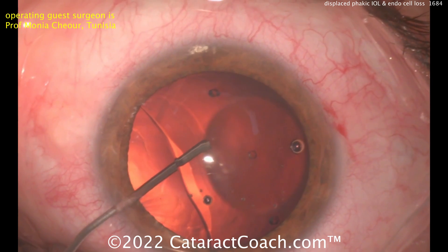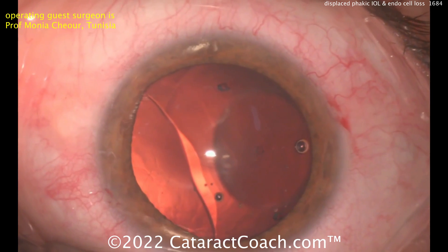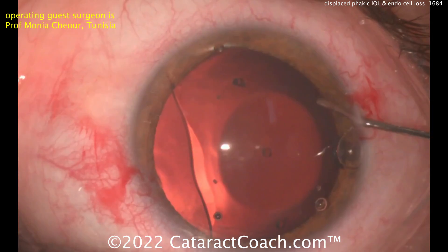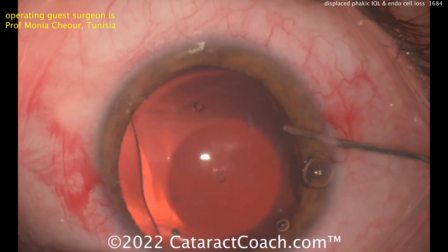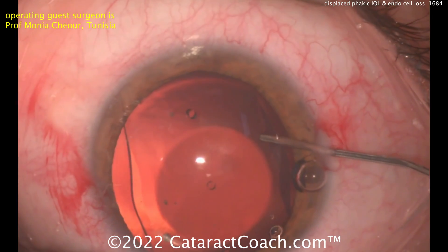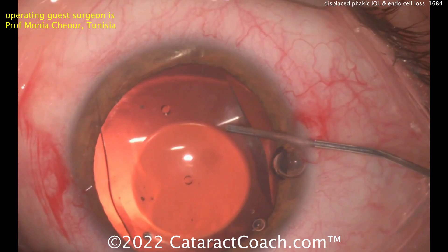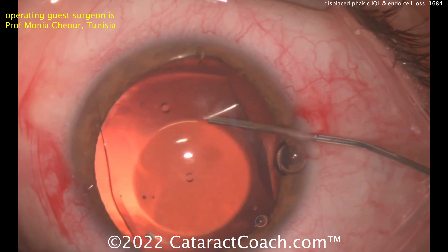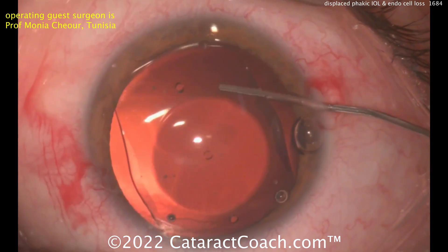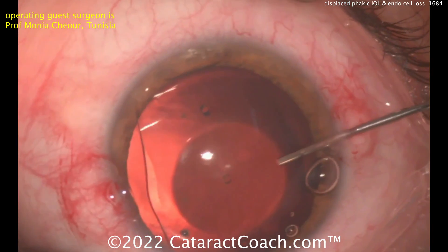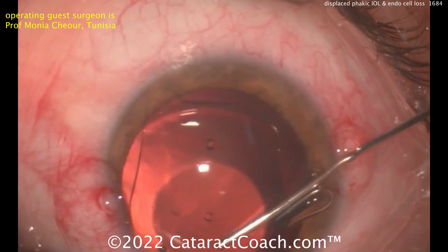So viscoelastic — this is dispersive viscoelastic underneath the optic to lift it up and get it away from the crystalline lens. Another option is you could take this lens out and leave the eye with the normal human lens, and then the patient can wear a contact lens. I'm not sure I'd go back in the eye and put another phakic IOL given that the endothelial cell count is now 1,600.